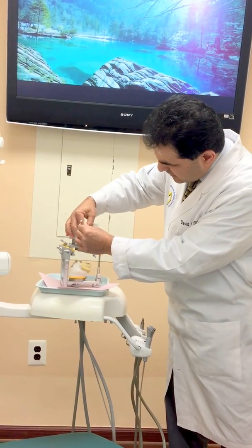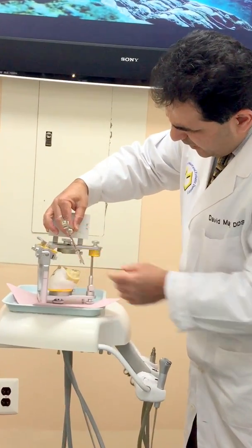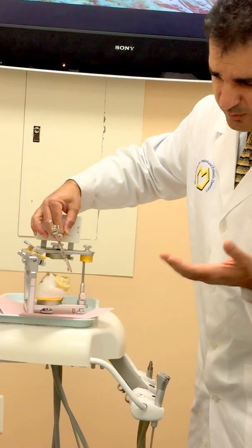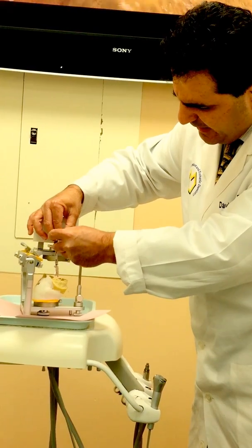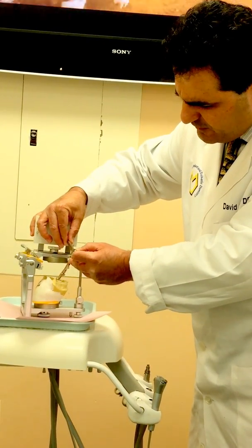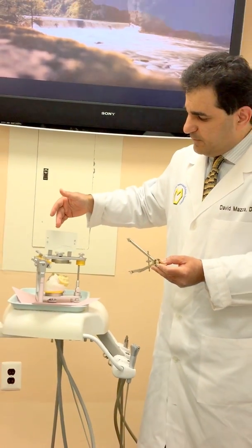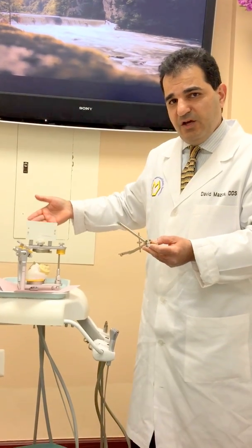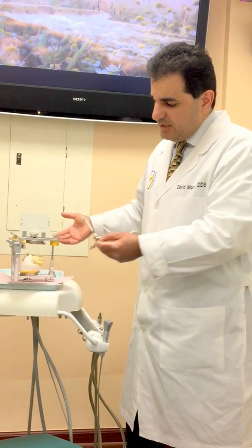If I place one side of my compass on that point — so the center point of the compass is placed at the intersection of the two arcs — I can go ahead and draw one of my compensating curves, which is the curve of Spee. This should also be repeated on the other side: this is the right side of the patient, and also for the left side of the patient.